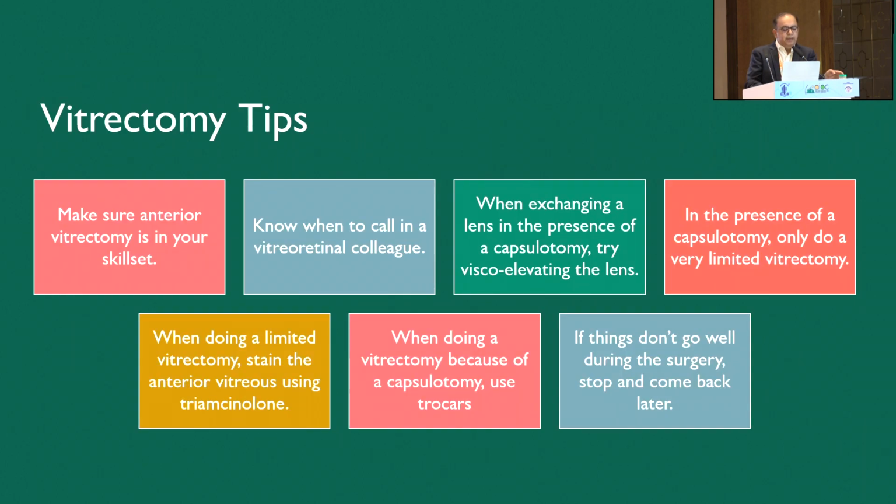So lastly, some vitrectomy tips: make sure anterior vitrectomy is in your skill set. Know when to call a vitreoretinal colleague. And when exchanging the lens in the presence of capsulotomy, try viscoelevating the lens. In the presence of capsulotomy, only do a very limited vitrectomy. When doing a limited vitrectomy, stain the anterior vitreous with triamcinolone.